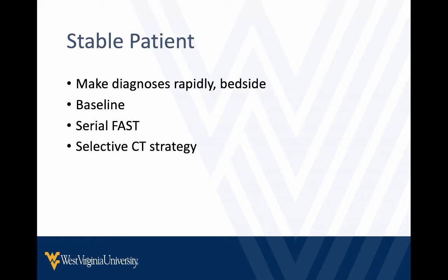Now in the stable patient, again, maybe a little bit more controversial, but I'm going to make my case to you why I think even in the stable patients, the FAST exam has an important role and can help us. It can help us in low resource settings where we may be working, but even in busy trauma centers like where we work, the FAST exam can help us tailor our decisions and triage who gets what resources when and how fast. If we see blood in their abdomen or we see a pneumothorax, then we know that information right up front and we know it at the bedside.